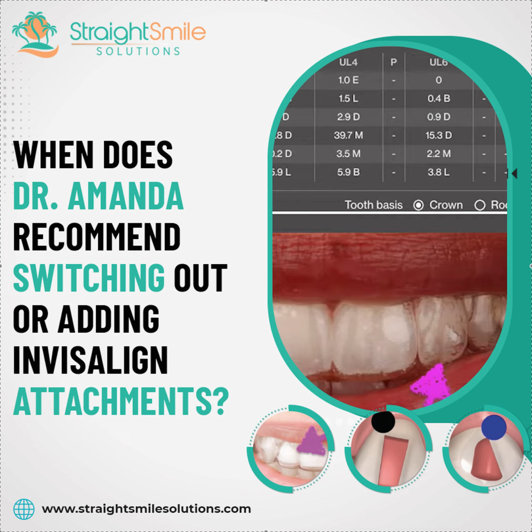Do I want IPR? Do I want flaring? Do I want proclination? Do I want expansion? Do I want sequential distalization? Do I want a lower incisor extraction? Do I want premolar extractions? How do I want to move these teeth? You need to drive the bus. You tell them how to drive the bus. They set it up. Then once they do that, if I like the rough movements, I'm going to double it.